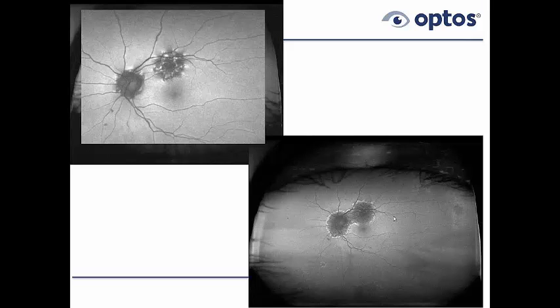Ultrasound is another safe procedure. Any OBGYN will testify that ultrasound is safe. They do it all the time, right on the surface of the abdominal cavity, and sometimes intravaginally. So ultrasound is thought to be safe. Of course, an ultrasound probe close to the eye would be safe as well. So in that instance, ultrasound's great, but it's not going to pick up a tiny little horseshoe tear. But the ultra-wide field imaging devices are very useful in those cases where you really don't feel comfortable dilating, or the patient doesn't want to be dilated.